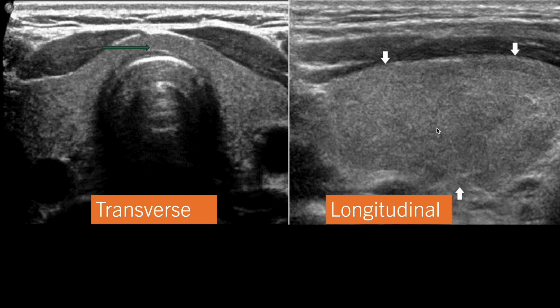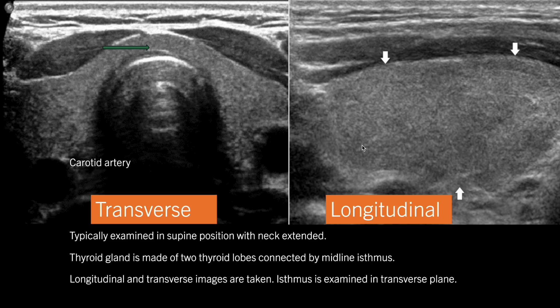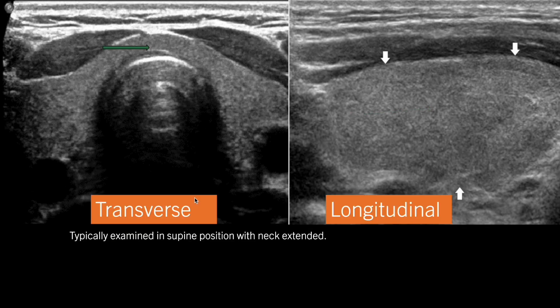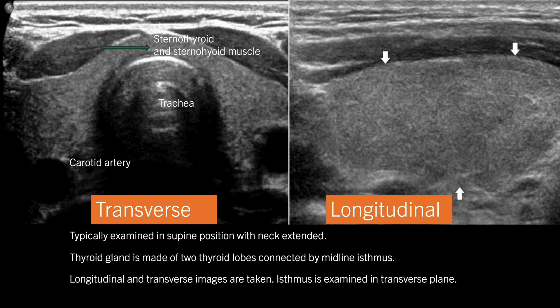In the longitudinal image of the thyroid gland we see this type of image — this is one thyroid lobe. The thyroid lobe is hyperechoic compared to the surrounding muscles. Here we can see the carotid vessels, the trachea, and the sternothyroid and sternohyoid muscles. Normally, the thyroid is examined in the supine position with the neck extended for better visualization.